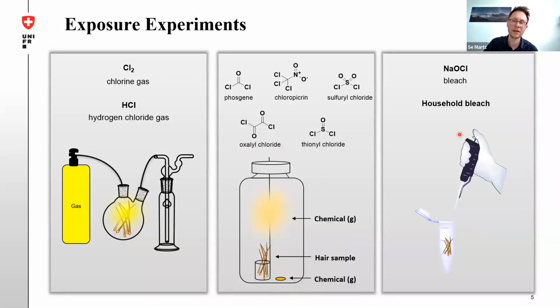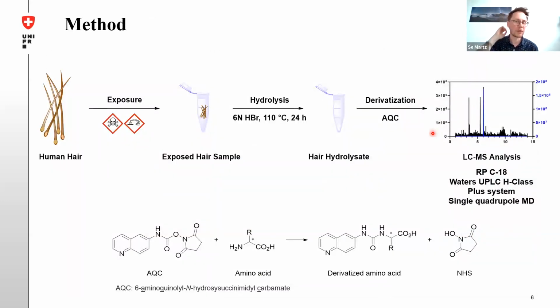On the right-hand side, you can also see the exposure experiments with bleach and household bleach. In this case, we need to immerse our hair samples in a solution with a specific concentration of these chemicals. Okay, now a little bit more information on the method.